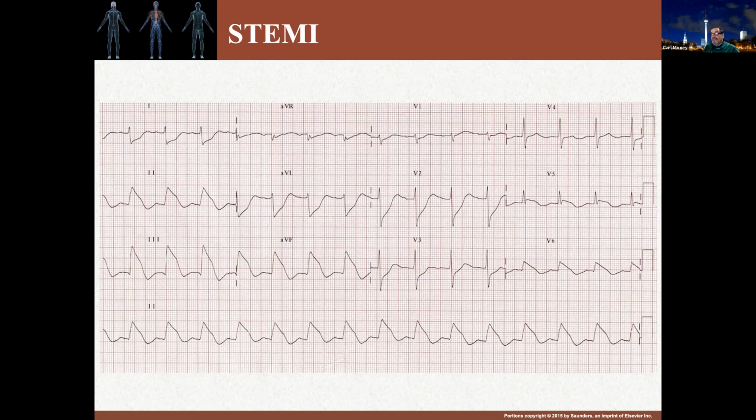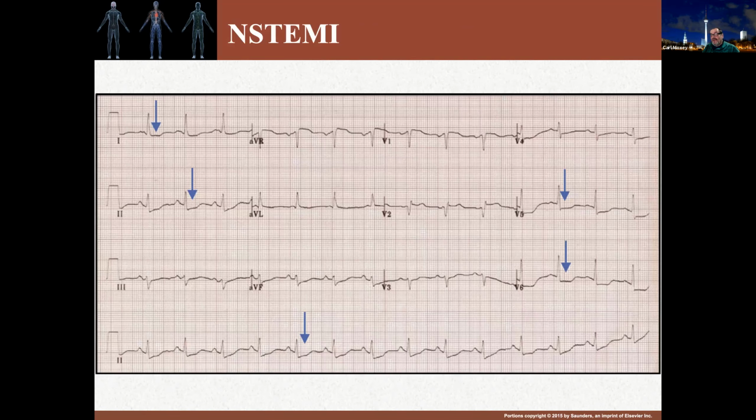And here you see an EKG tracing of a STEMI. And here is an NSTEMI. And you can see we have, instead of an elevation, a depression shown by the little blue arrows here in the various leads.